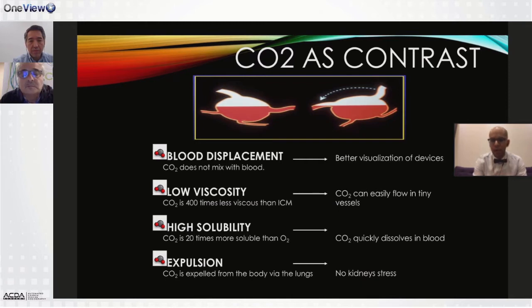It has very low viscosity. It can go into very tiny spaces, very tiny vessels. It finds a lot of things that you might not see with contrast, for example small AV fistulas and small shunts. It makes dissections look a little bit worse sometimes. It can find endoleaks very well, but sometimes it can overcall them. So it comes with time and experience of what to call and what not to call, but it tells you it's very versatile.